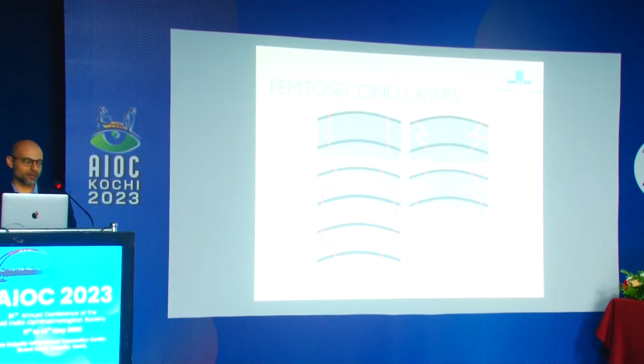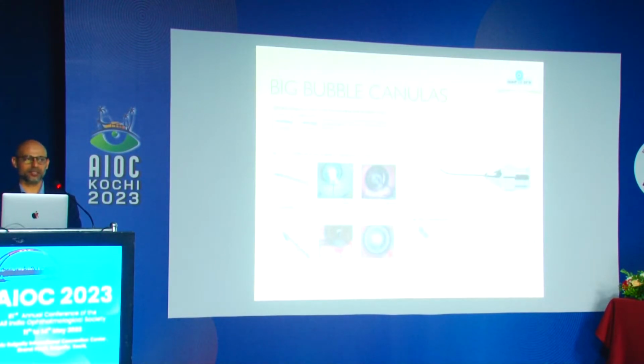Femtosecond lasers, of course, are very expensive to refine, but yes, they do work beautifully well, especially for DALK. You can go for the mushroom cuts where you can remove more stroma and have a narrower posterior cut, and it will help you go to the desired depth. You can even make a track to introduce your cannula to get a perfect big bubble. And because the cuts are so well shaped, the new button also fits in perfectly like a manhole cover, and you can probably get better apposition with less astigmatism.